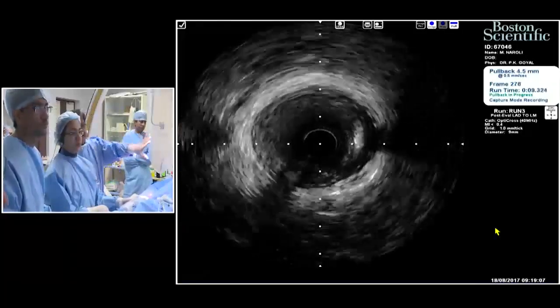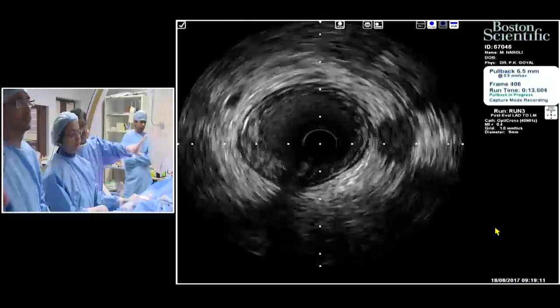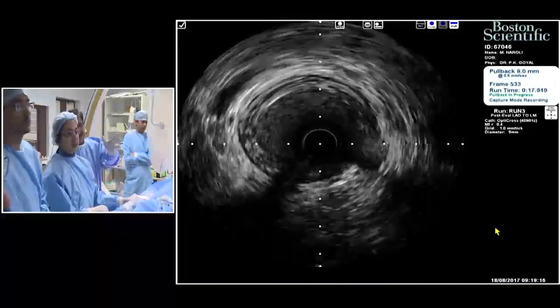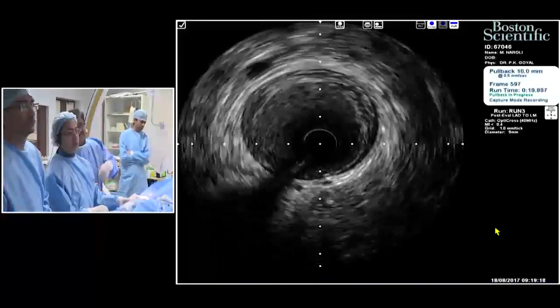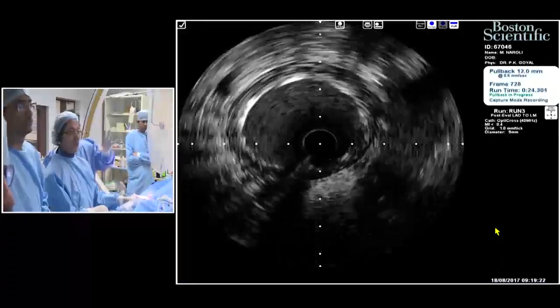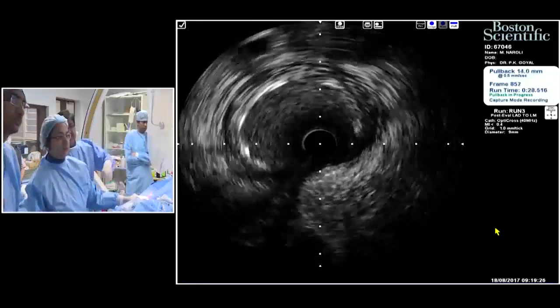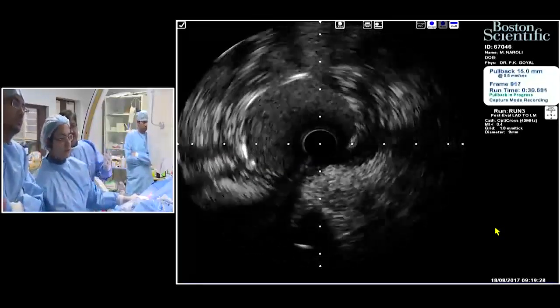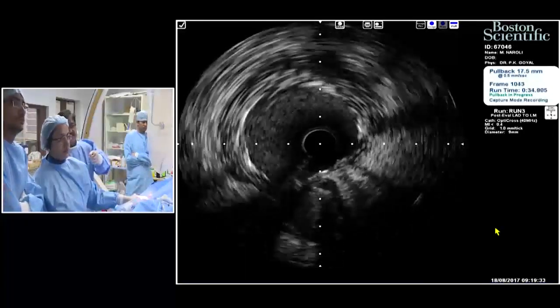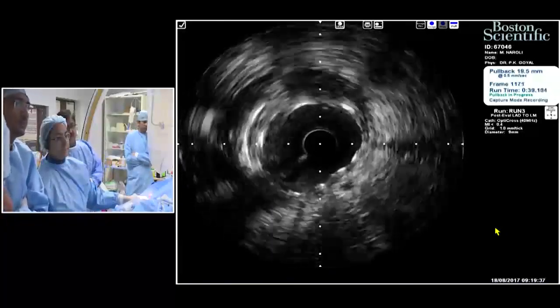Now, as I come back, there is less disease. So I have put my stent in normal to normal, so-called. So this is normal. Some mild plaquing, a diagonal type vessel coming up, and then the stent. So the stent is absolutely in the normal segment. It's reasonably well opposed there, and we have that septal coming up there, I think. The expansion looks okay for the stent.